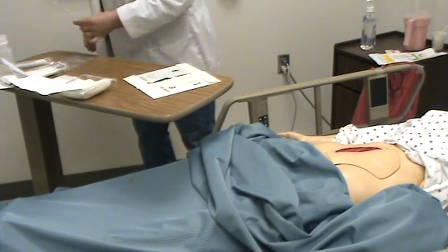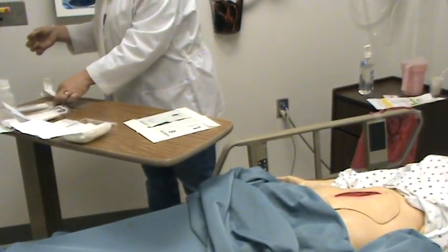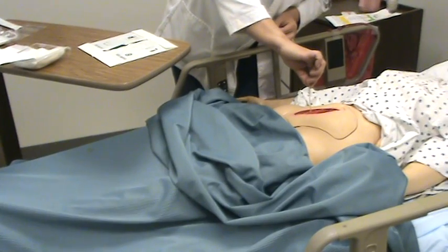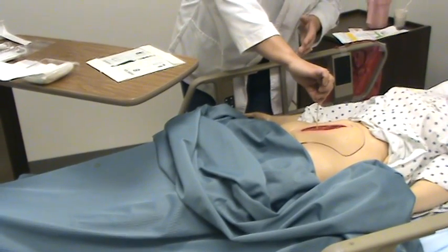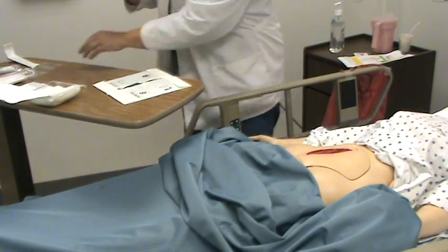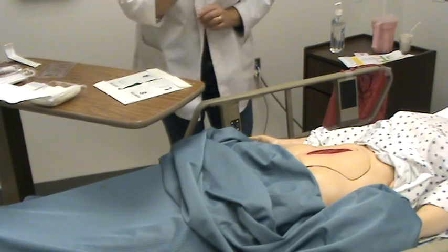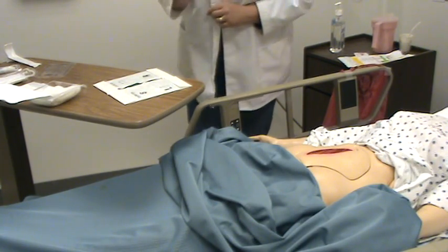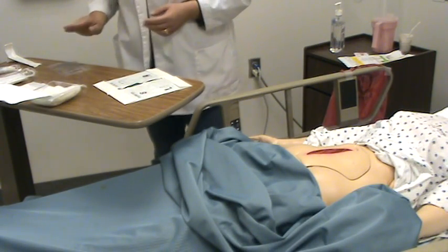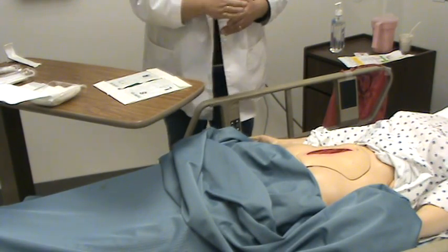Since I opened the cotton tip applicators with one of them out a little bit, I can go ahead and just take one without contaminating the other one. I'm going to put this in the saline, and technically if the wound was a real wound, it would get dampened so I can see the depth. Otherwise you can take your finger and go down — just don't be touching the wound. Then I would measure accordingly, putting it up to the measuring guide to see the depth of the wound. I also want to note the other measurements of the wound. If you did touch the skin, toss it. So now I have information about the skin and the wound itself.